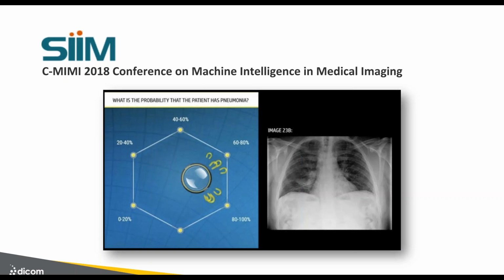it works. And so this is one of the ways that the industry is attempting to solve this issue of how do you feed supervised data, meaning annotated data, so that you're not leaving the neural network to figure it out on its own. And so this is a very interesting way to solve that issue.